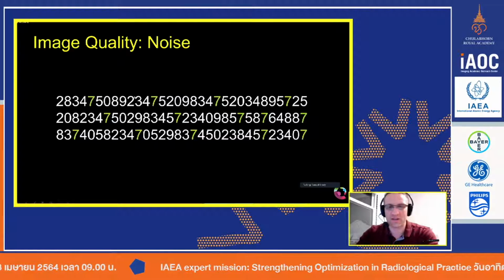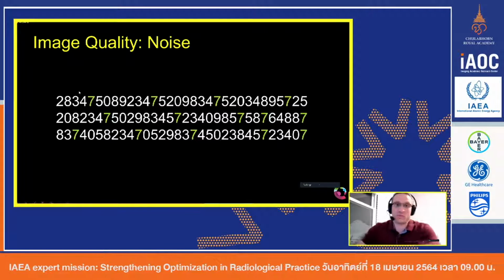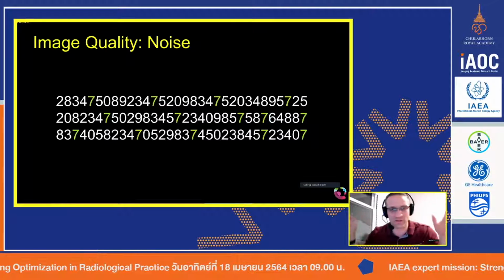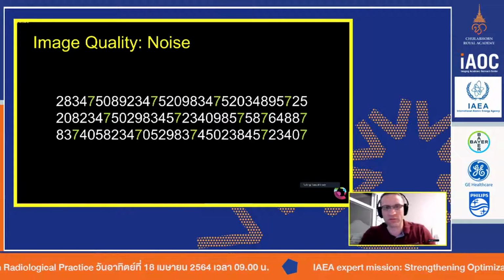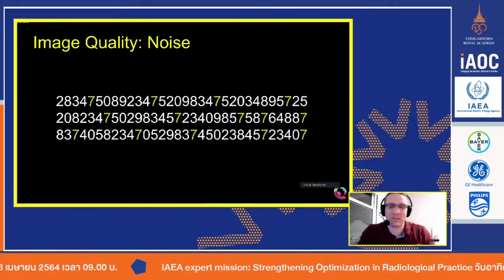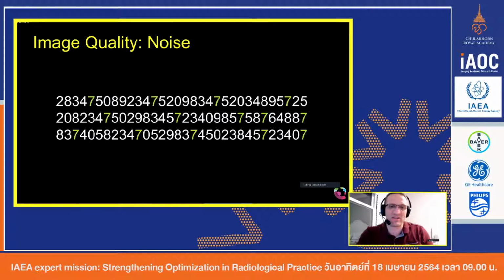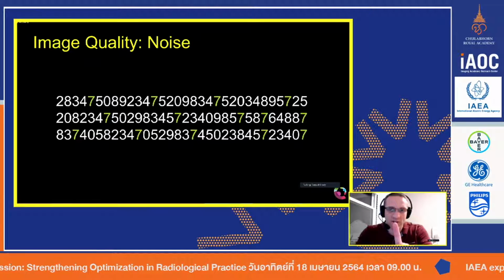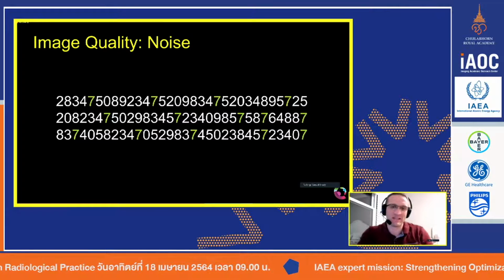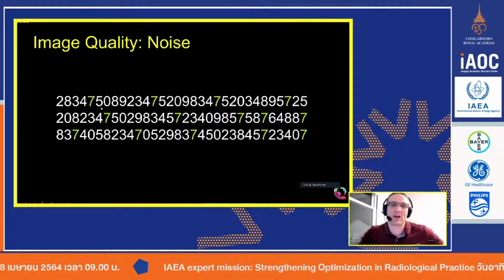So the idea here is that in fluoroscopy, we have really low dose imaging. And we need to, because we may be doing fluoroscopy for 20 minutes, 30 minutes, an hour, 2 hours, whatever the interventional procedure is, or whatever the general fluoroscopic procedure, like doing a reduction in a pediatric patient that's having some problems in their abdomen. You're going to be imaging more than just one shot, like you do with an X-ray, or 20 or 30 slices in a CT scanner. You're going to be doing this in time. So each image has to be low dose, and the noise content is going to be pretty high per image.